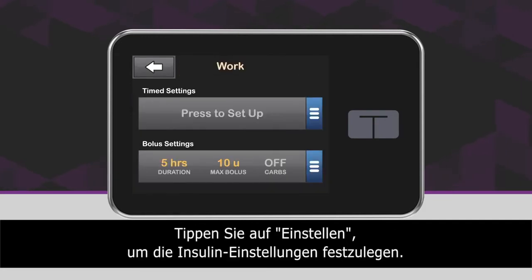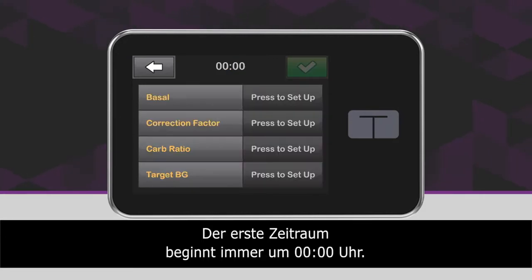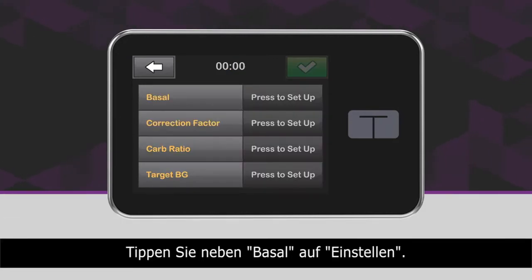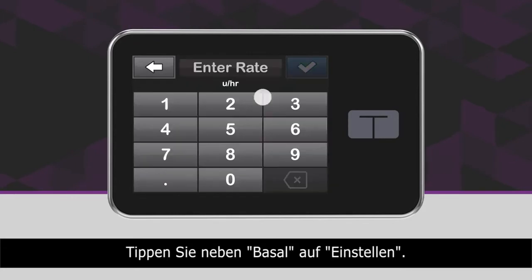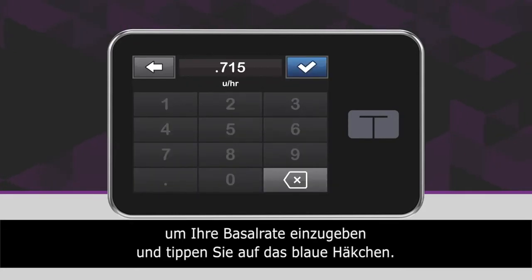Tap Press to Set Up to begin setting insulin delivery settings. The first settings you enter always start at 12am. Next to Basal, tap Press to Set Up. Using the on-screen keypad, enter your basal rate and tap the blue checkmark icon.